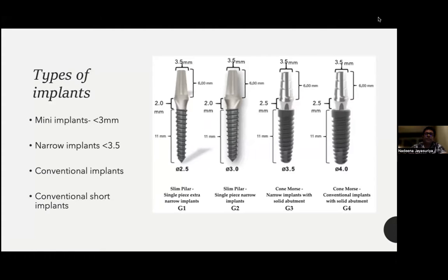And after that, a part of the implant, it's a single unit, part of it is outside, and then you take measurements like for a crown and bridge preparation. And then once the technician sends the crown, you just paste it on this. So it was a very easy procedure, and still it is practiced for very narrow areas. But in a mini implant and in a narrow implant, the implant components are all in one unit. That means the implant fixture and the other part, the abutment part, is one component.